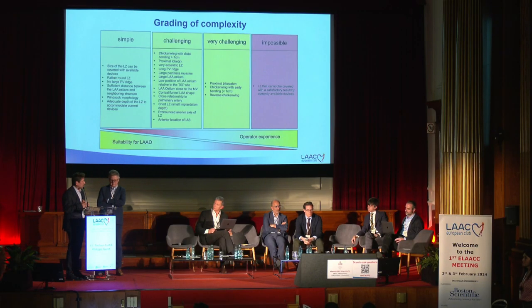I think it's really important, and the next discussion we'll have is about how to grade the procedure, because as you said, some of these parameters are device specific, and some combinations give completely different results in terms of complexity. If you have something elliptic, but it's not too proximal with no lobes, etc., it's okay. But if you have to challenge a complex transseptal origin plus a reverse plus something with pectinates or something like that, this becomes almost impossible to close.